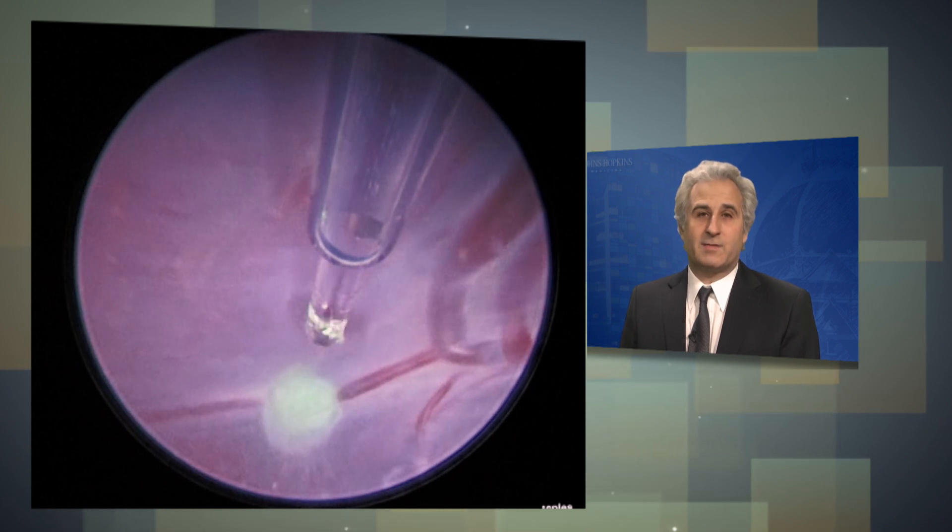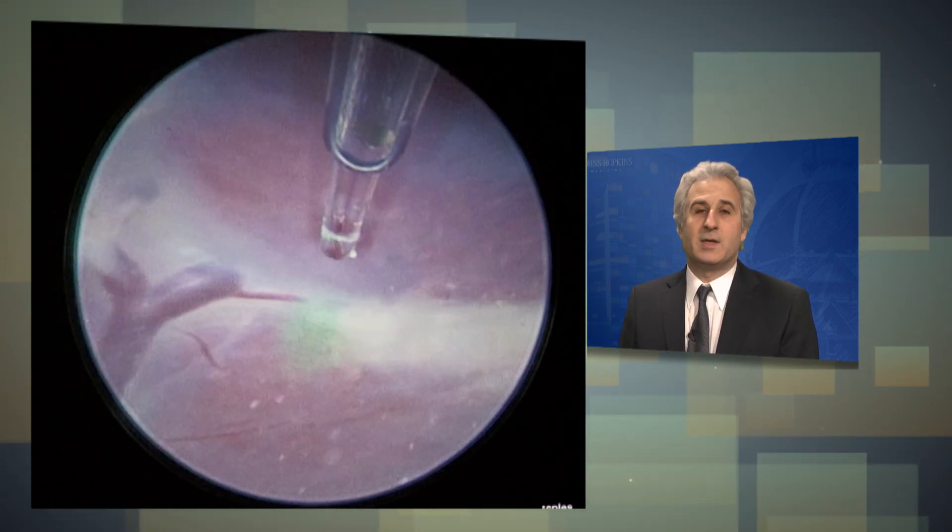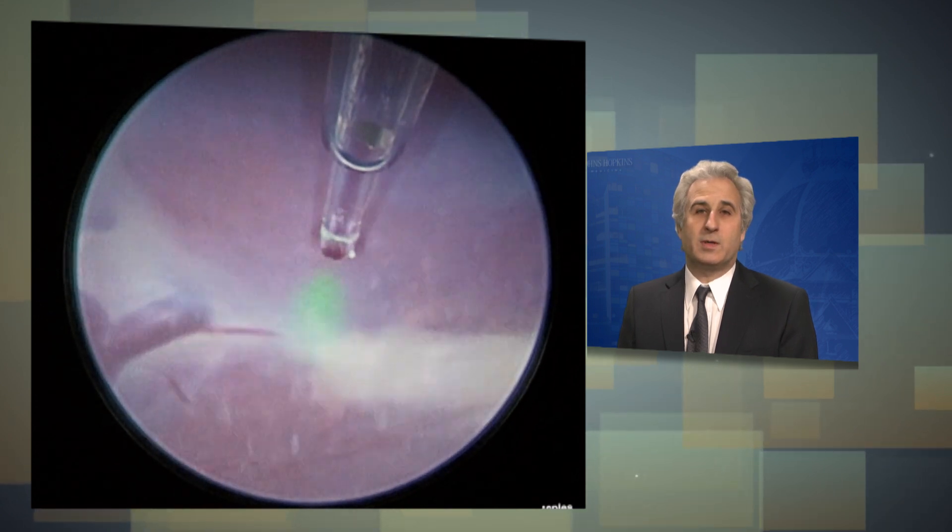Once we identify these vessels, we will then bring in the laser fiber and coagulate them until they're completely white, so we are sure there is no blood flow between the two twins.